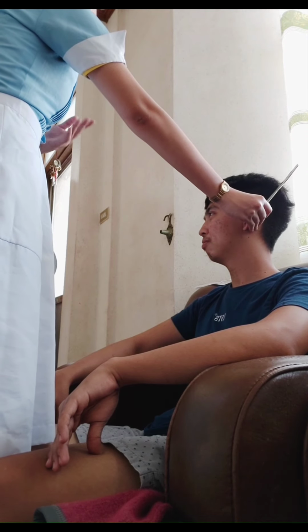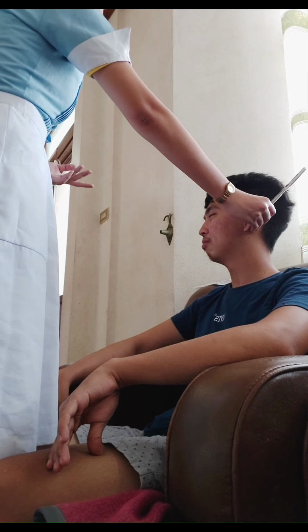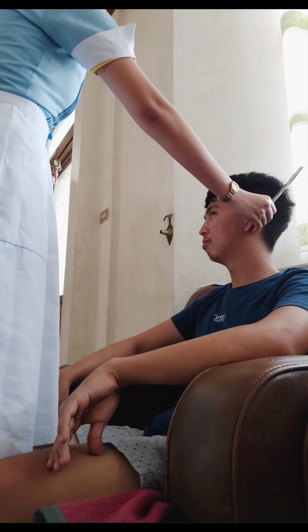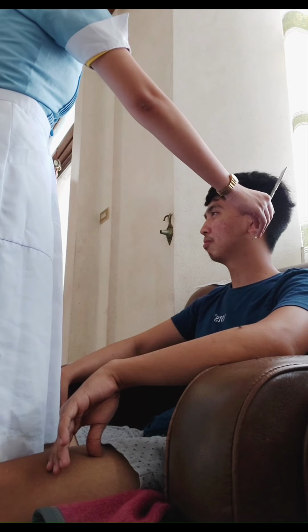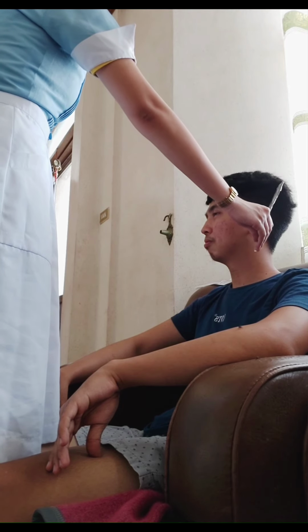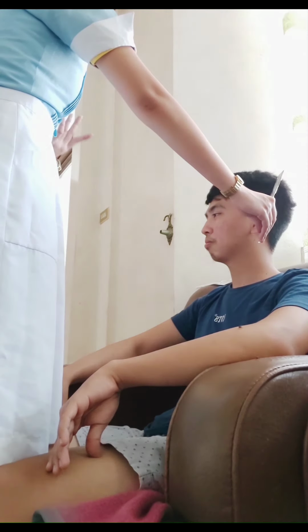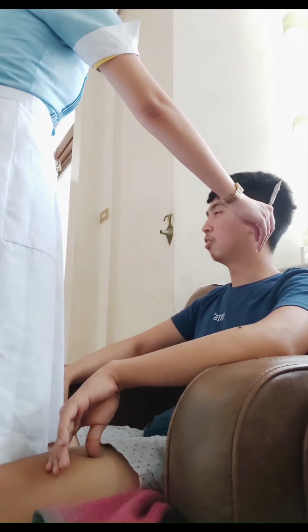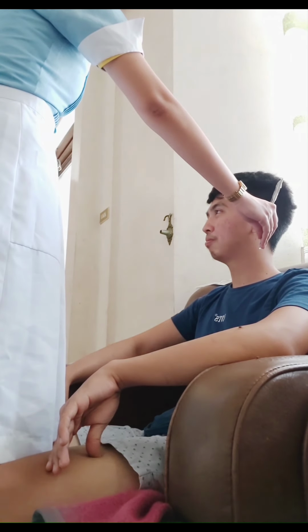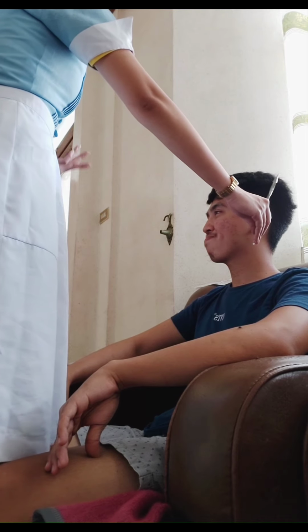Allow it again to stay there for 2 to 3 seconds to appreciate the intensity of the sound. Then now I will move the tuning fork next to your ear canal. Can you tell me again if you can no longer hear that sound? Can you signal me again? Is that okay with you? Okay. Then now I will record the length of time you hear each sound.